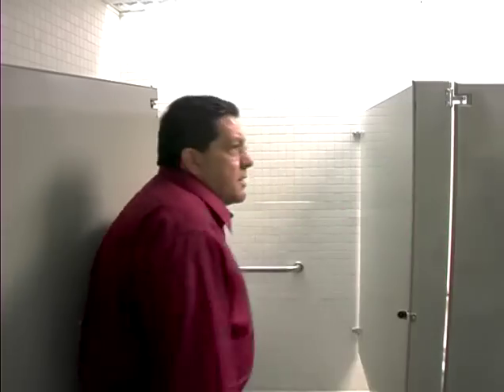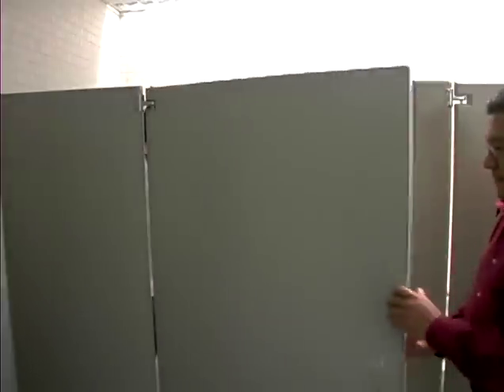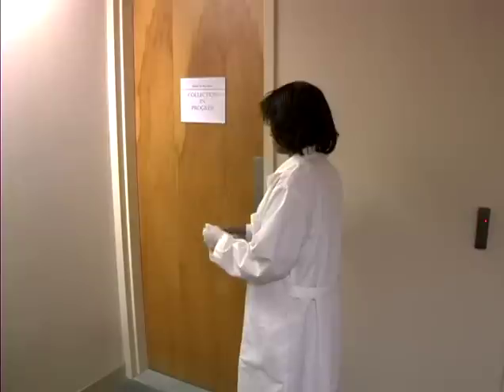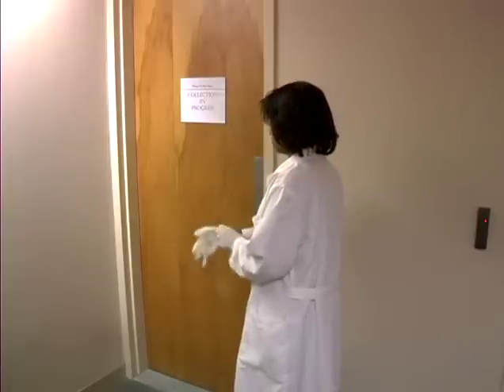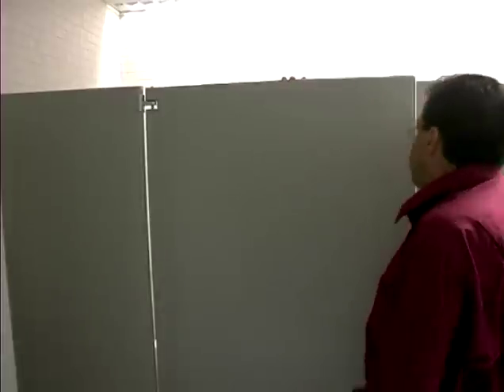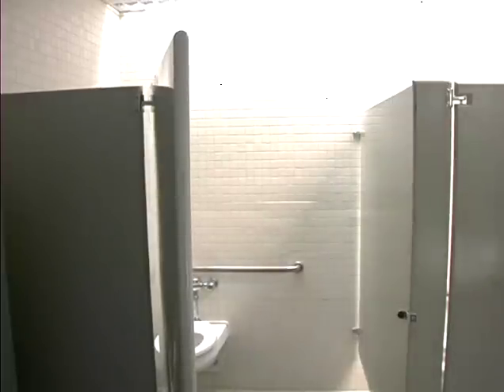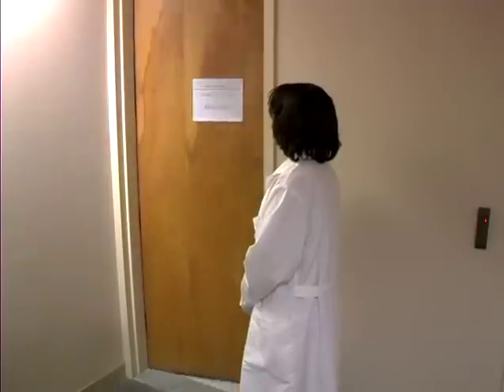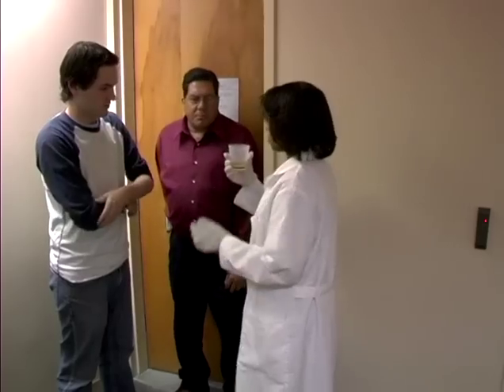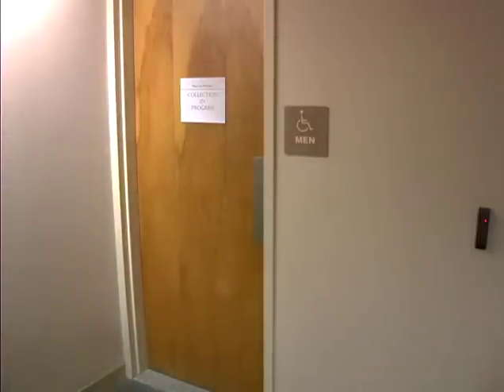The monitor does make sure that the donor takes the specimen to you, the collector, as soon as the donor leaves the stall. The monitor must also watch the donor hand the collection cup to you. The monitor is there to watch. He or she is not part of the collection process in any other way. Make sure that your monitor does not take the specimen from the donor. The monitor's name must be included in the remarks line of Step 2 of the custody and control form. Once the donor hands you, the collector, the collection cup, you can follow the collection procedures outlined in the previous section, Specimen Collection Procedures.